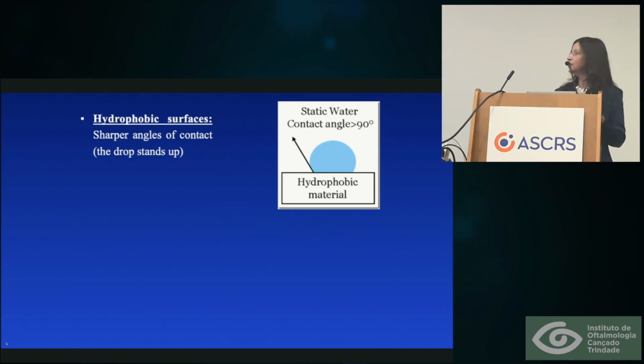Is there a suitable material for the sulcus, one that's better than the other? So just as a small background, we usually classify these materials as hydrophobic or hydrophilic according to the water content, but also you can measure these characteristics by using tests such as this, the contact angle in water.